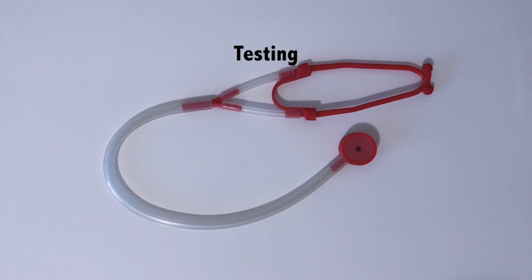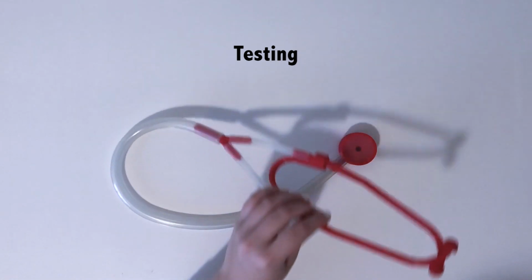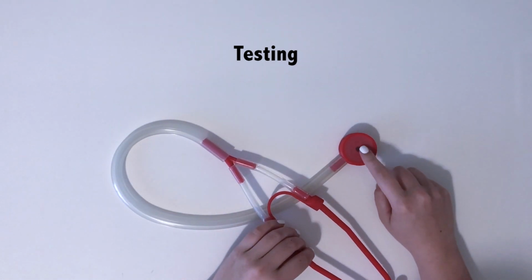Once your stethoscope is assembled, try it out by placing the headset into your ears and gently tapping on the diaphragm. It should sound loud and clear. You can also test it out by listening to heart or breath sounds.